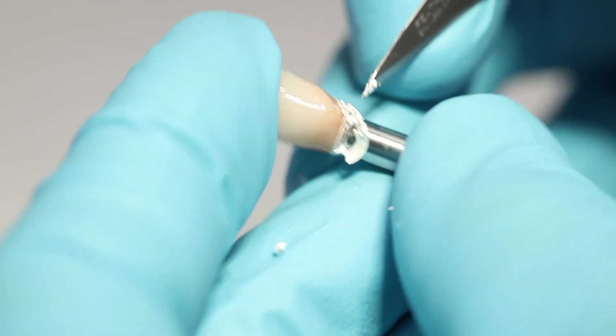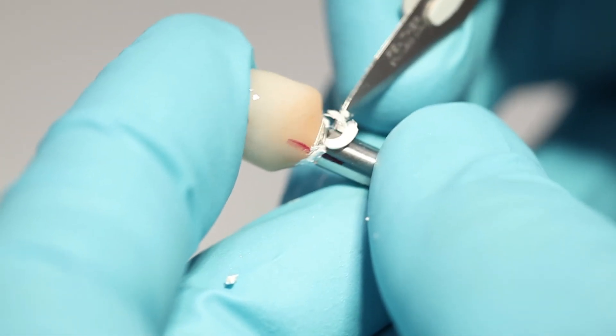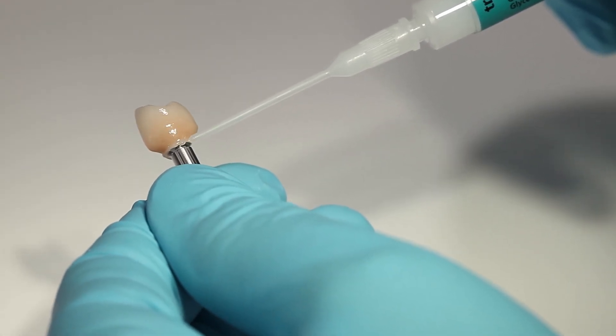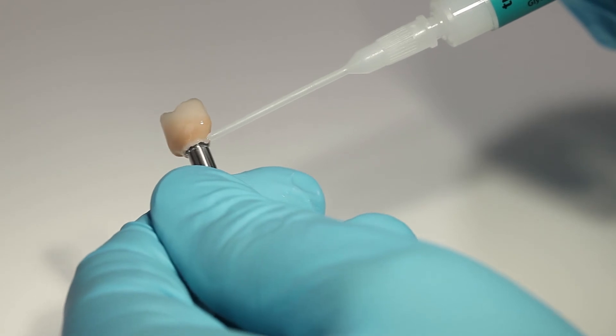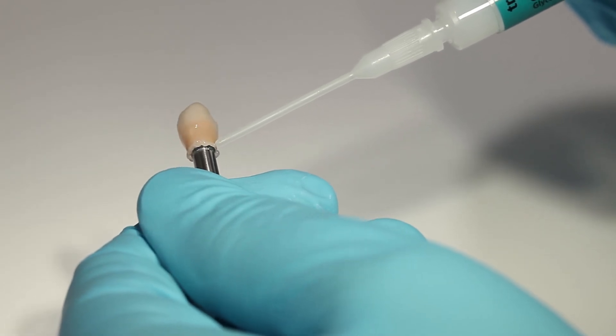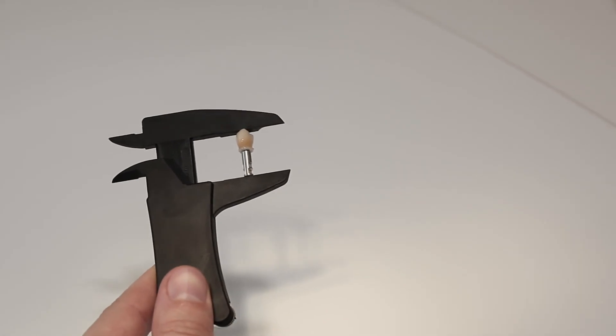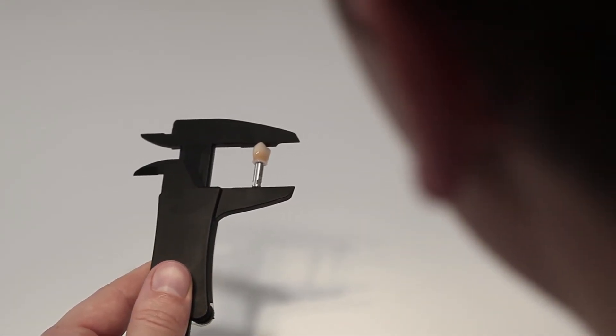For the clean-up, use a suitable instrument such as a LeCron. Apply glycerin gel such as liquid strip to the cementation joint to prevent the formation of an inhibition layer before the luting composite auto-polymerizes. It takes multi-link hybrid abutment approximately 7 minutes to auto-polymerize.